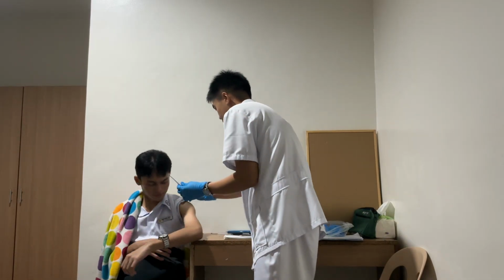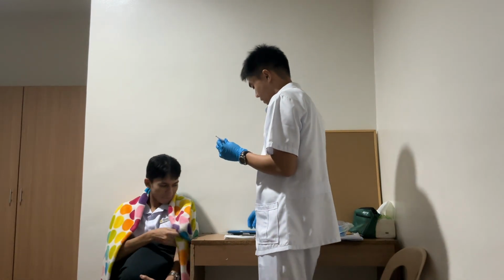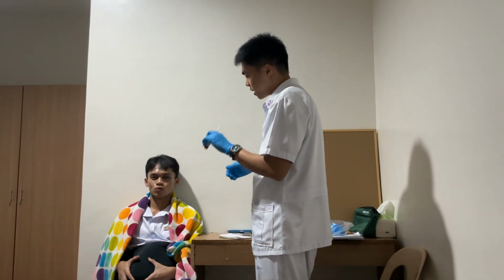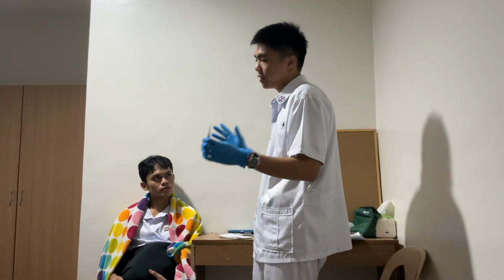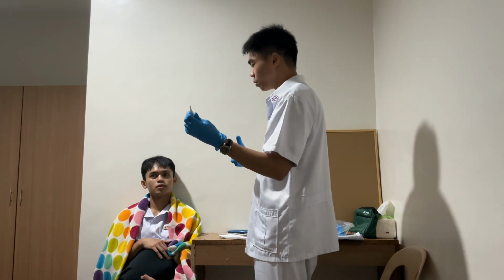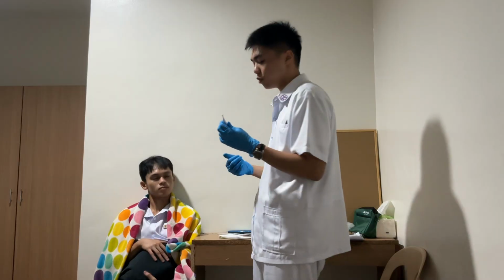So ma'am, I'll just roll down your sleeve, make it comfortable. Thank you, ma'am. So the reading says 36.7 degrees Celsius. So 36.7 degrees Celsius po, ma'am, is actually normal. So the normal range is 36, 36.5, give or take, 36 to 37.5 degrees Celsius. Anything above is hyperthermia, too hot, and then below is hypothermia, too cold. Okay?